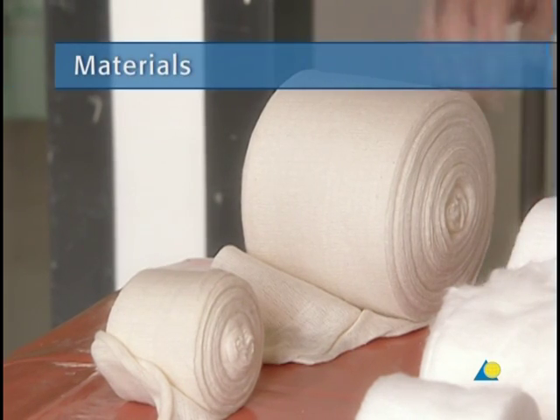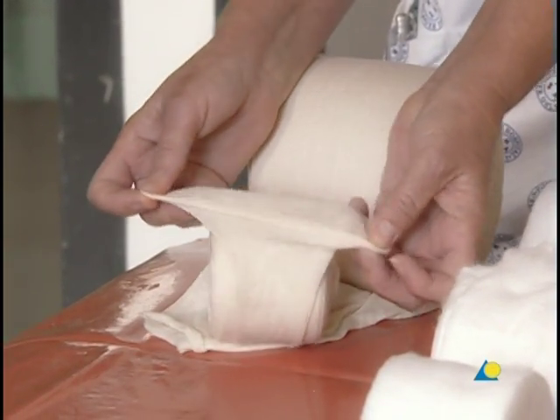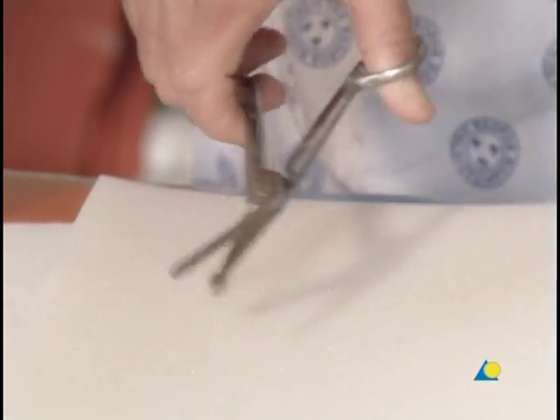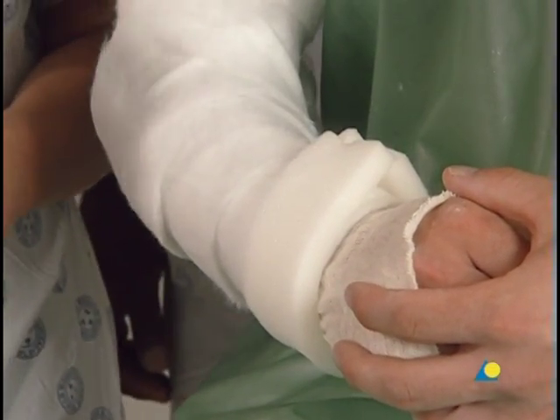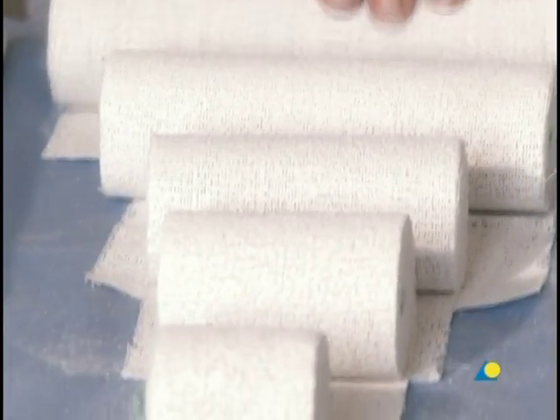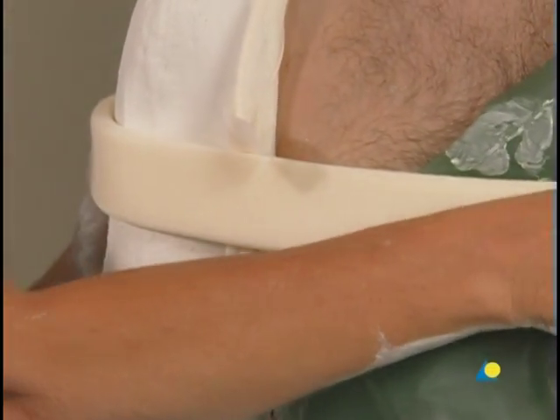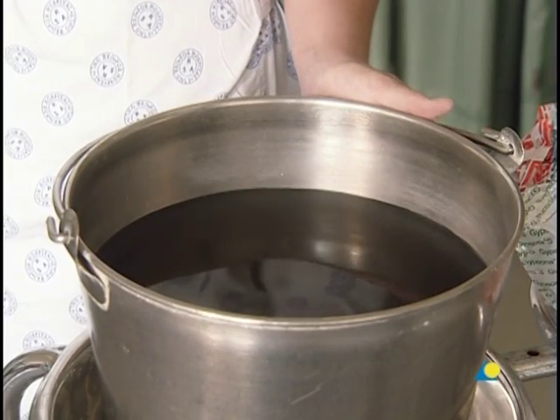To apply the modified shoulder splint, the following materials are needed: a stockinette or tubular gauze bandage; cotton wool for undercast padding; scissors; a rest-on pad, or alternatively orthopedic felt, made from compressed wool and used for extra padding at the wrist; plaster of Paris bandages in rolls of varying widths; plaster slabs, generally five layers thick and available in differing widths; a soft cotton sponge bandage to secure the splint at the upper torso; and water or another wetting agent.